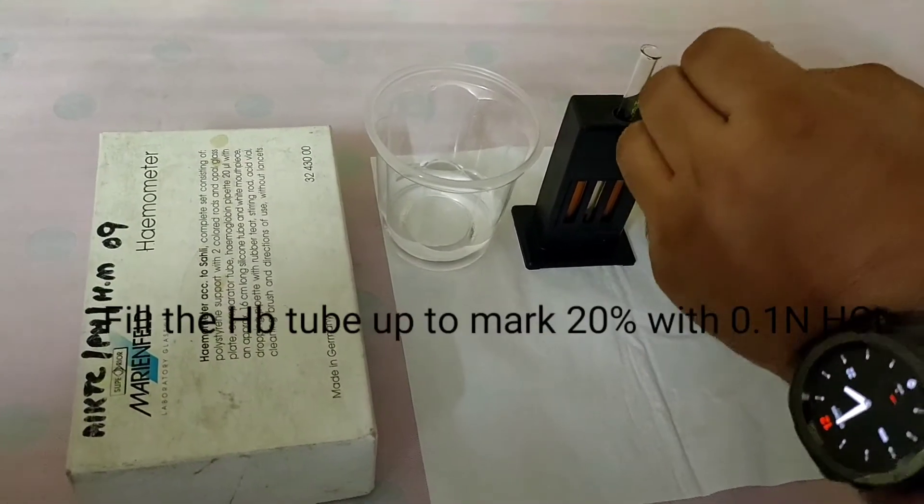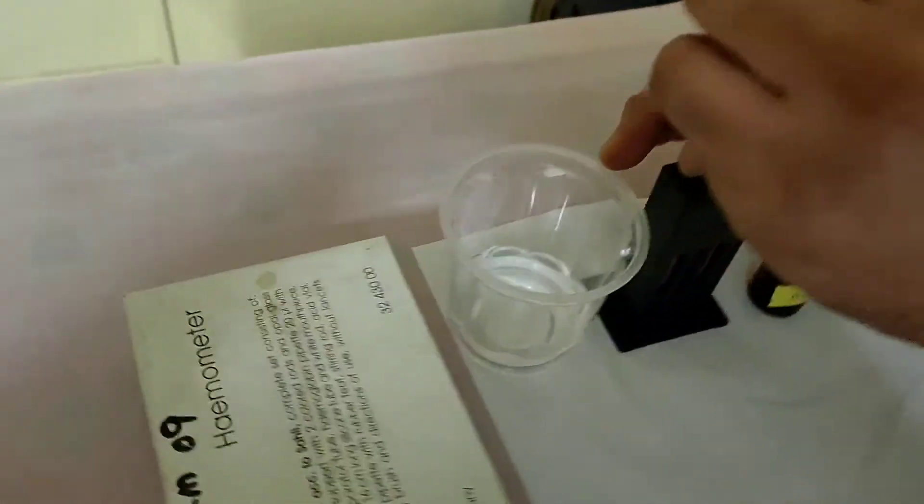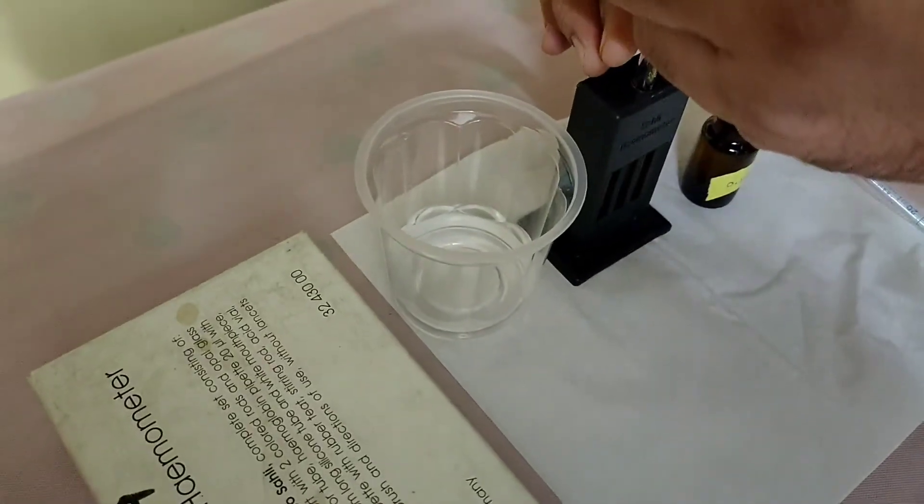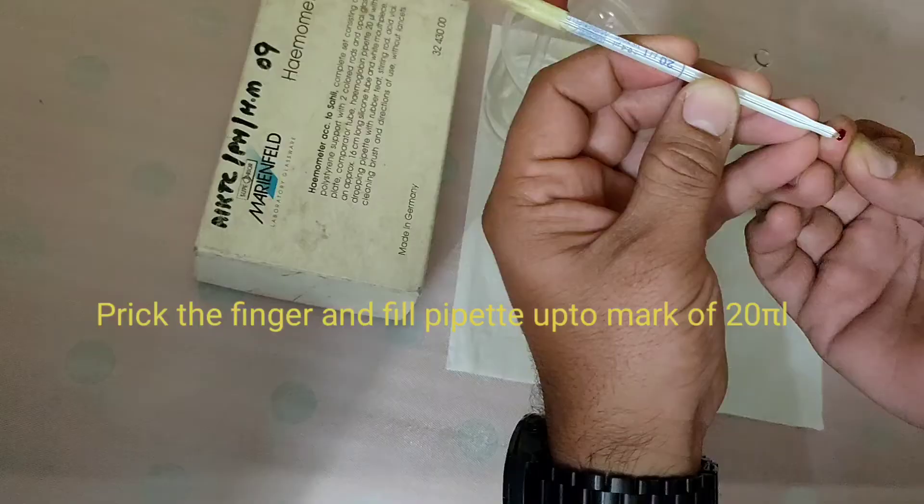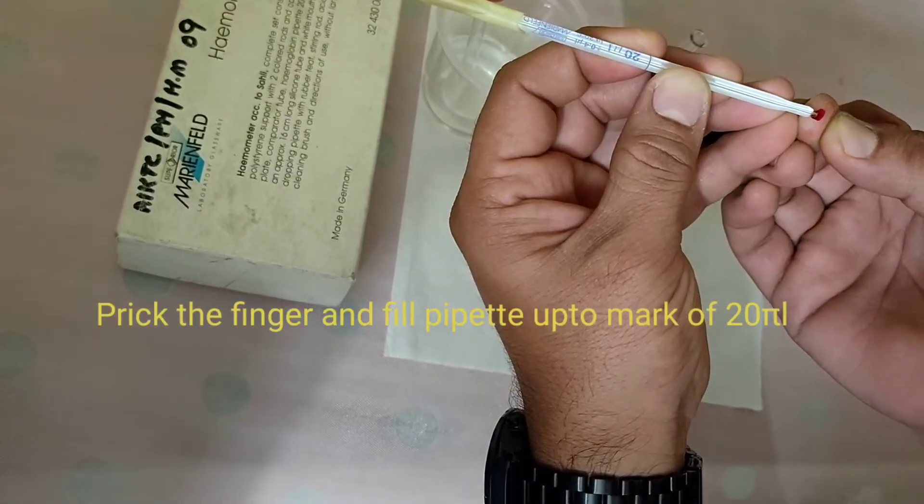After filling the HB tube with 0.1 normal HCL, then prick the finger and fill the pipette up to the mark 20 microliter.